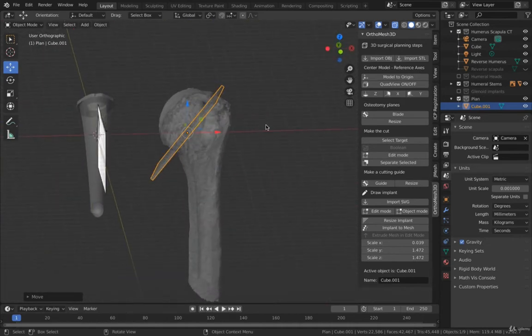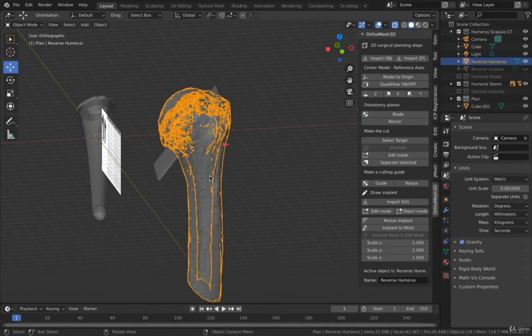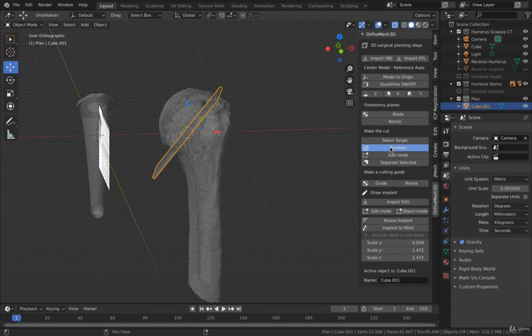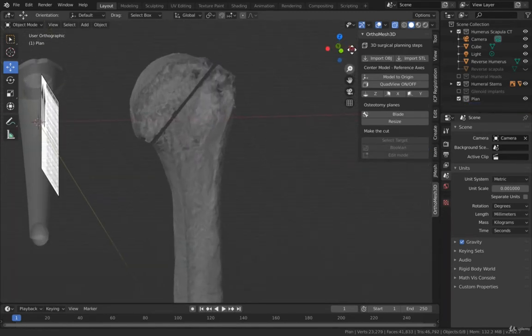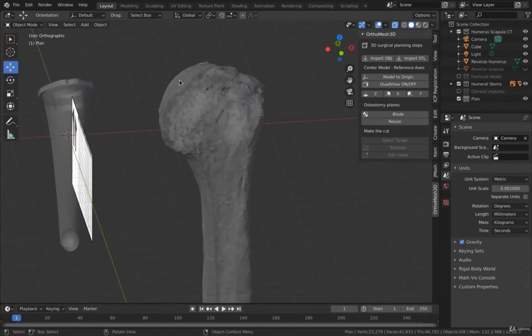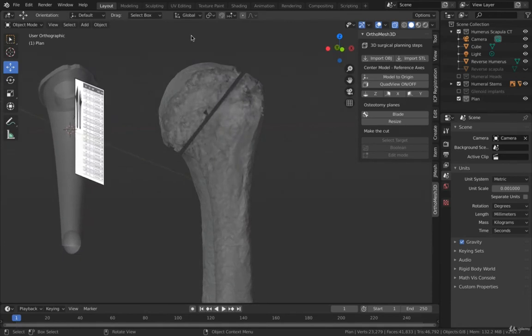Now, one of the things we can do here is we can select the humerus and say select targets, make the cut, select the blade, and do the boolean operation. And now we have made the cut on the humerus. Now we have to measure this. That's what we would normally do in a normal situation, but also separate it.